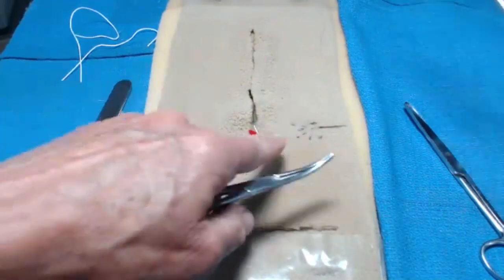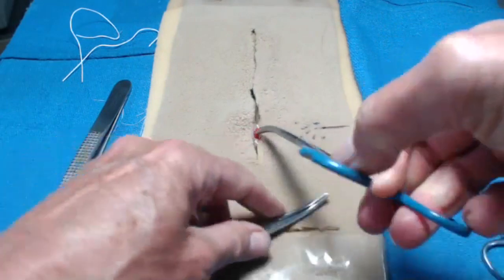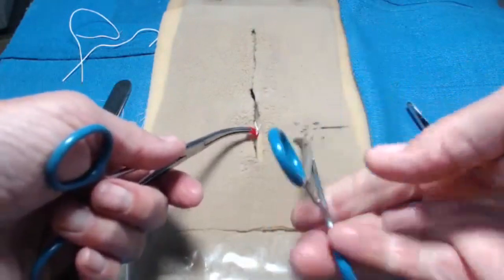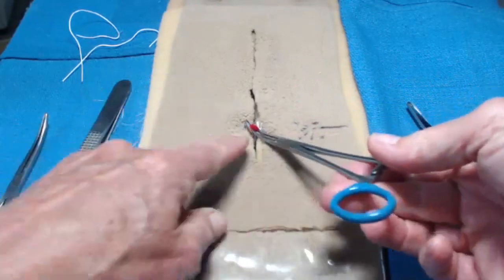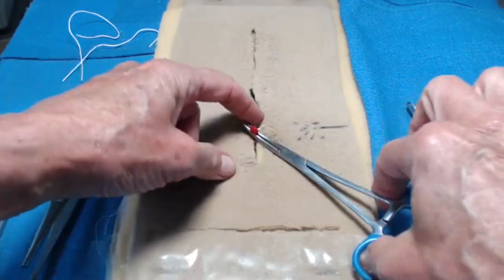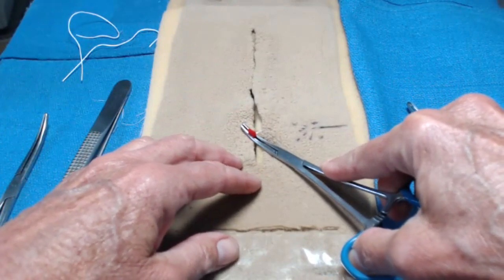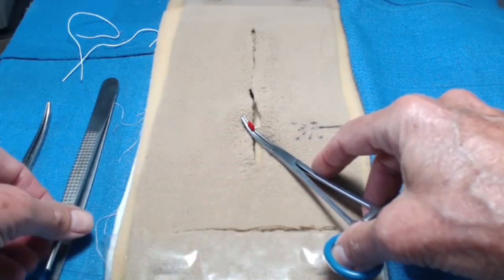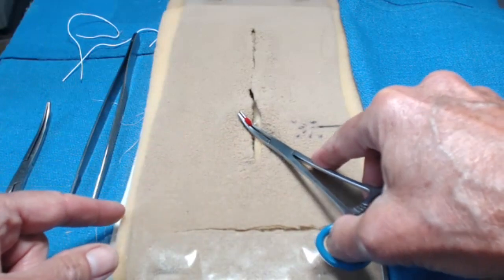Occasionally if you can only see where the vessel's bleeding, you might grab it like this — it might not stop it but you've got a hold of the tissue around it. Then you can apply your clamp across and take the first one off before you place your free tie. If you've placed the free tie and you're not sure whether you're occluding it well, you can release slowly to see if it's still bleeding and reapply if needed — that's called flashing. It's not done very often, but if you're not sure, certainly don't release it completely.